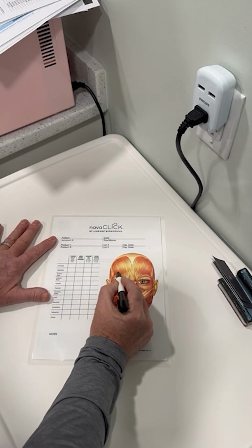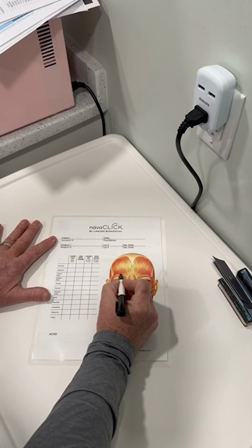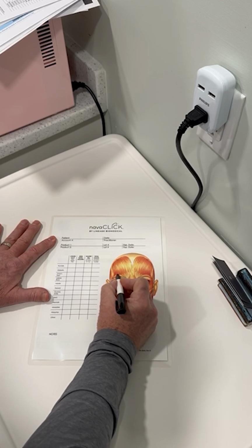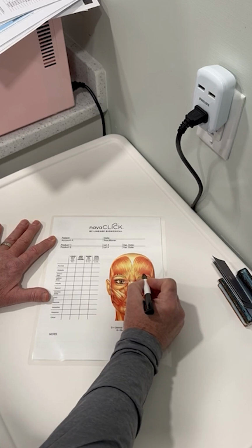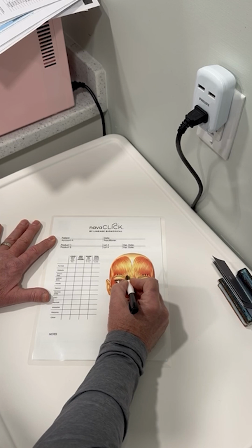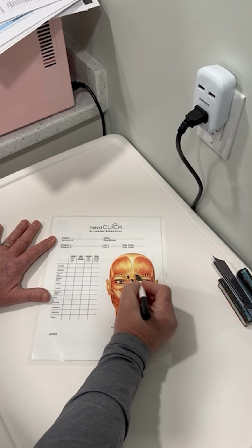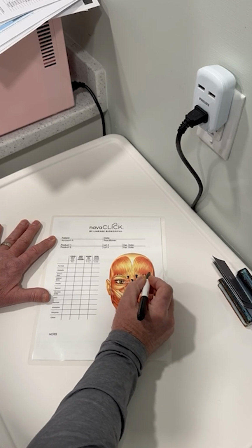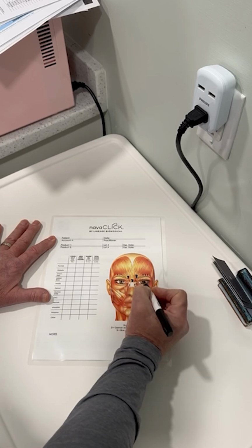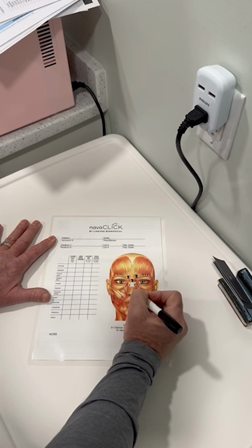So I have these vertical lines here, so I'm going to focus on my corrugator tails because the strength of my depressors come lateral. So I'm actually going to put 3 units on each lateral tail, spread apart, and I will mark that before I inject it so I know exactly where I'm putting it. And then my corrugators, I'm going to do a 3, a 3, and a 3. And I'm not counting clicks right now. I'm counting Botox units right now. And then I'm going to put 1 in each bunny line. Okay, so that's my map of the glabella and the nasalis.